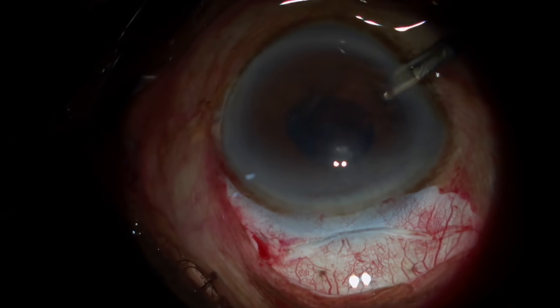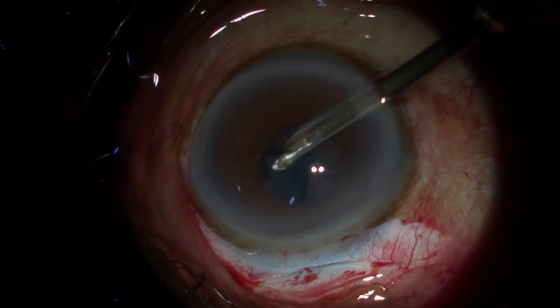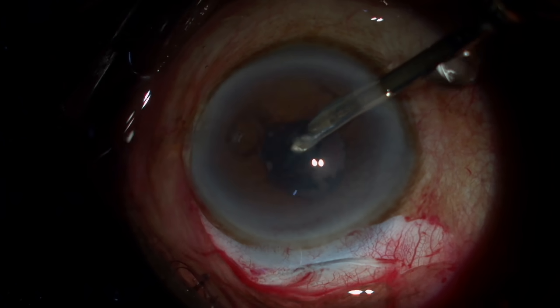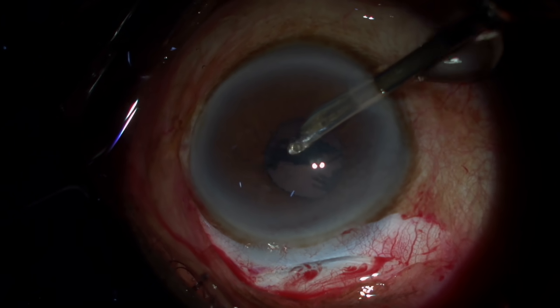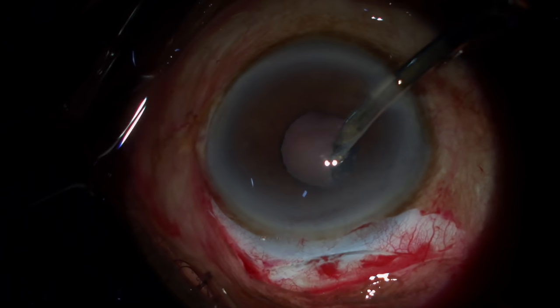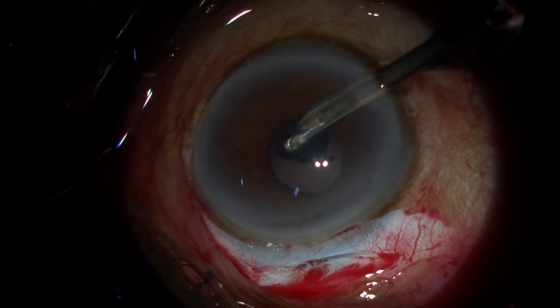For sub-incisional cortex, you can use the side port where the anterior chamber will be formed. Whichever direction you're holding and pulling the cortex, you should always go to the opposite side. For example, now I'm going to take the cortex from 11 o'clock — once I get a hold of it, I go towards 4 o'clock, it rips properly and then can be aspirated.